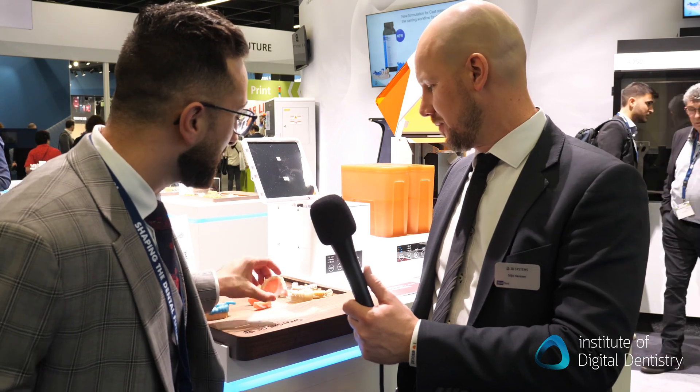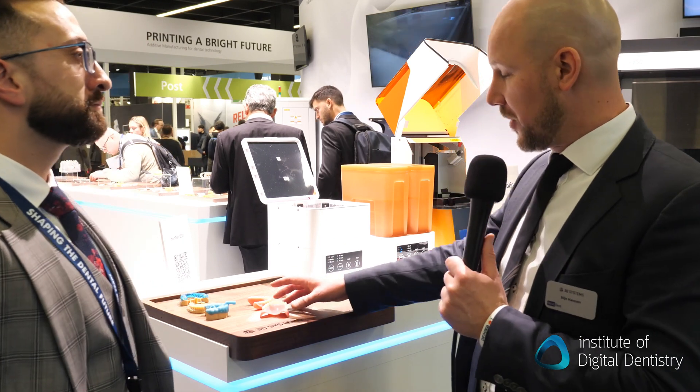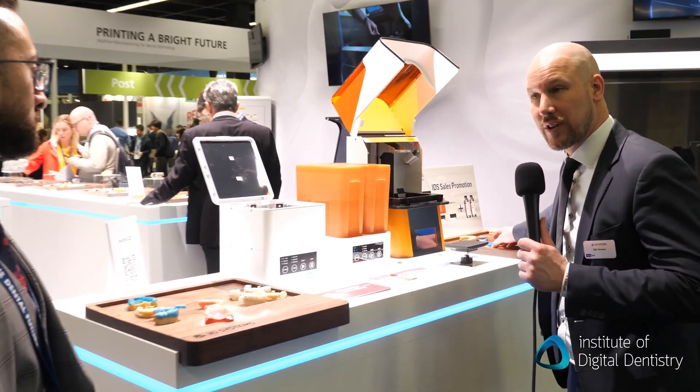You mentioned there are two new materials coming out — a new base and what else is coming up? So the base is very interesting — it's a class two material, for both the clinical and laboratory side, but more for the laboratory side.